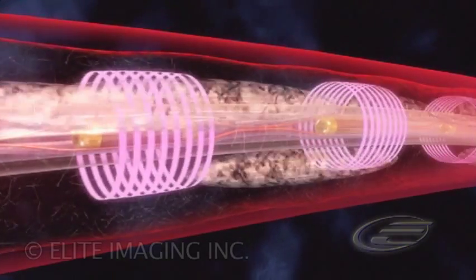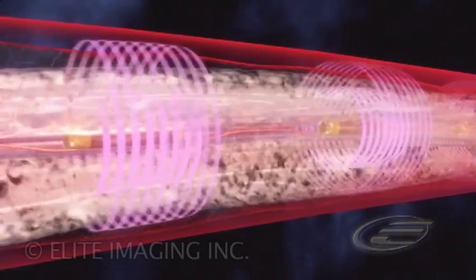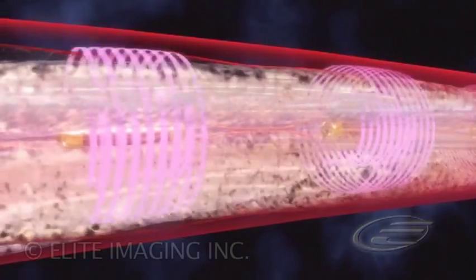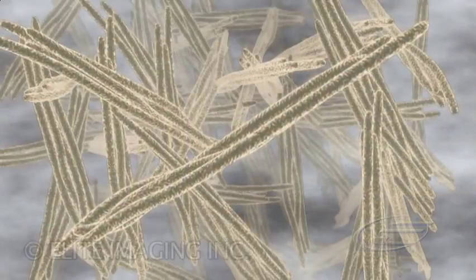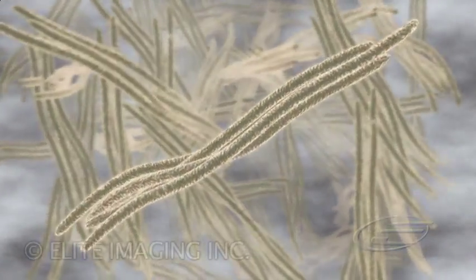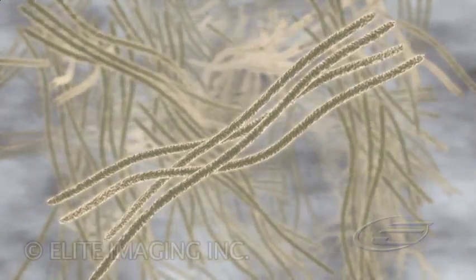Activation of the lysis system increases permeability of the clot and generates radial pressure driving drug into the inner volume of the clot. Simultaneously, aggregates of fibrin disassociate into individual strands.